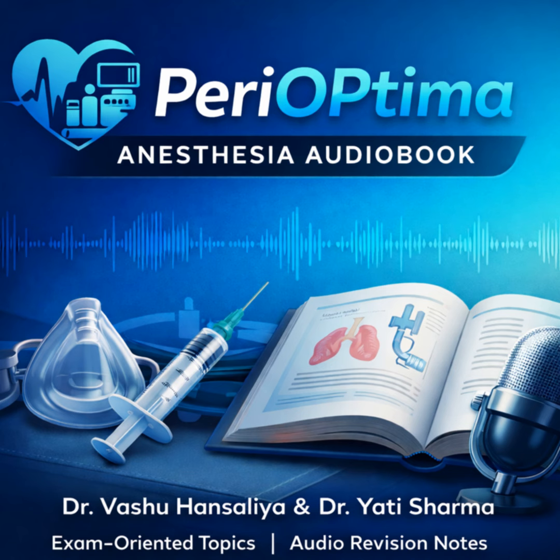So what does this all mean for the future anesthetist? We've talked about how video laryngoscopy has mitigated some of the risks of FOI, especially that blind railroading step, and it's often faster. But FOI still holds its ground in severe anatomical constraints, like extreme C-spine immobility or severely limited mouth opening. So the question is, will FOI always maintain its formal gold standard status in the face of these rapid digital advances? Or will training eventually shift away from flexible scopes towards advanced digital visualization?